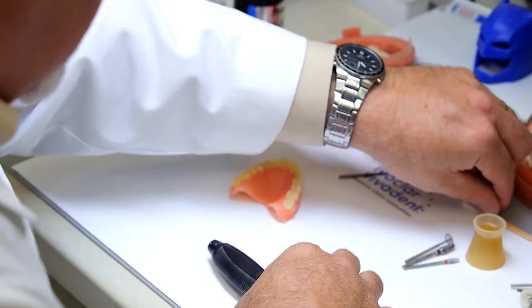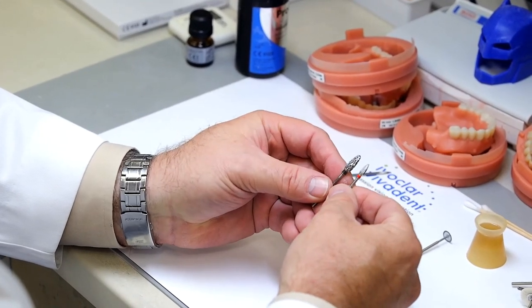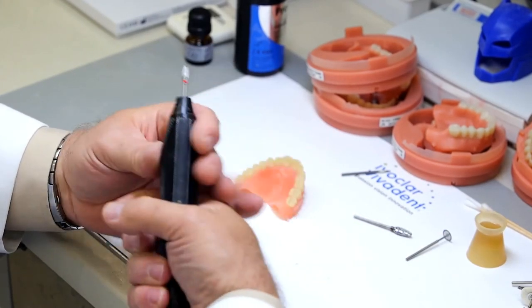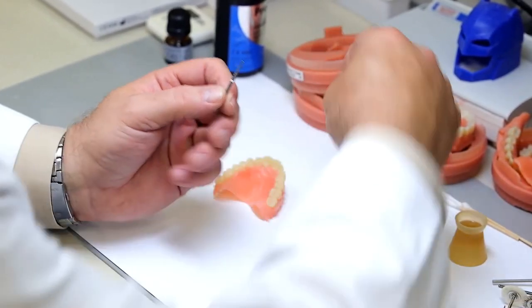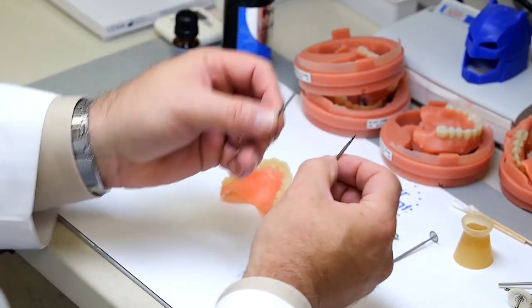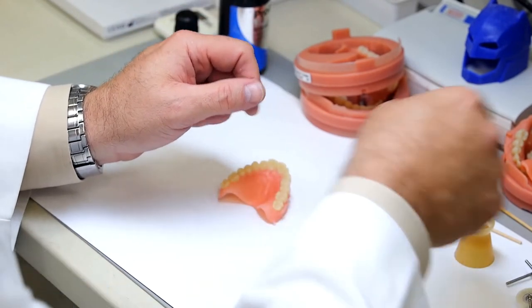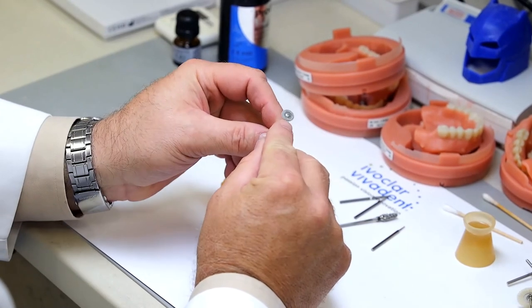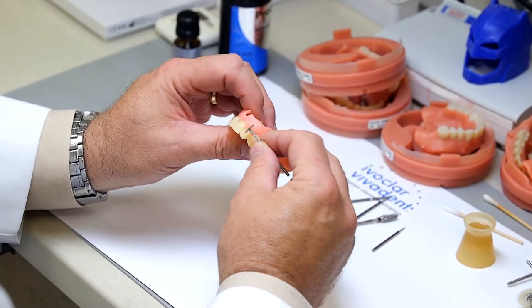I use a few different items here. This larger cross cut or a smaller one, it's your preference. I prefer the smaller to take down the sprue attachments. This cross cut can also be used in place of this three-sided cutter to take it out of the disc if you choose to use something like that. I have a number two round burr for contouring the gingival areas. I have a 10 millimeter double-sided diamond disc. It's a little flexible. This is what I'll use to open up the embrasures.